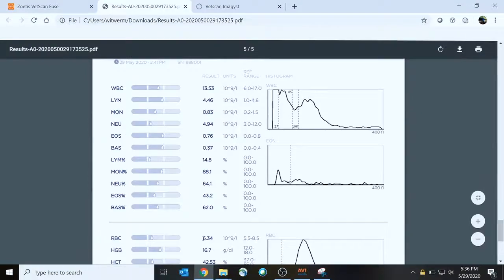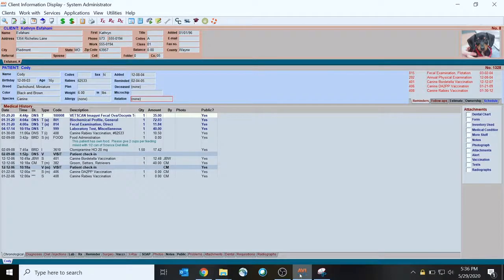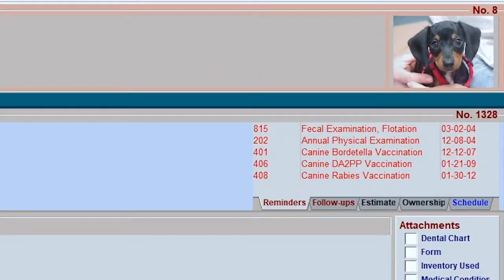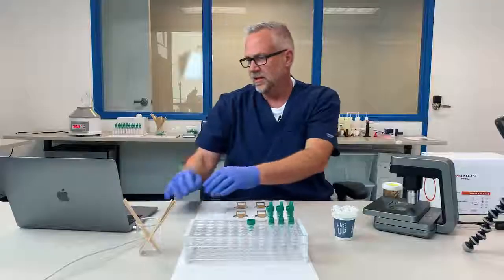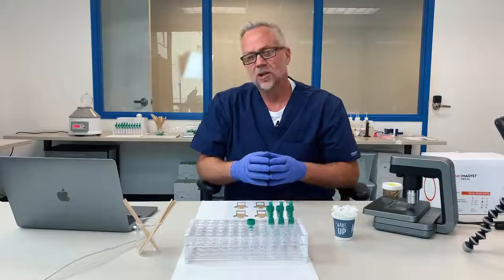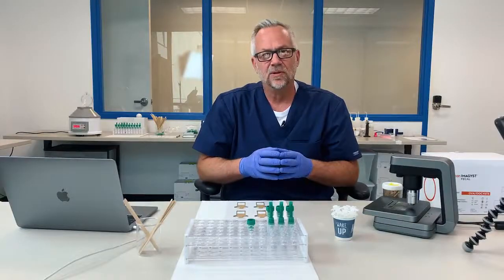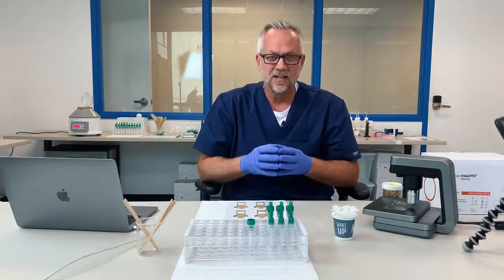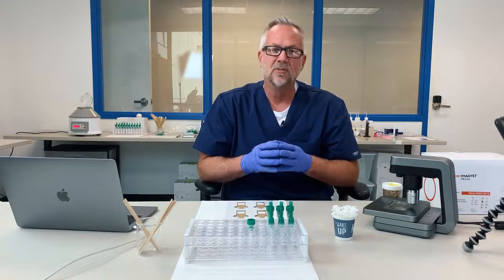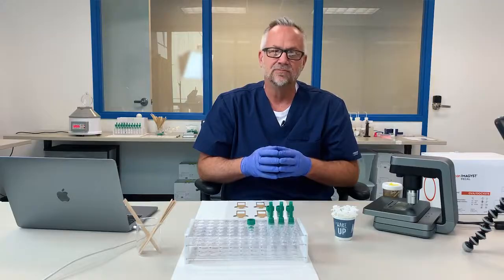Or back in their PIM system under the correct medical record for Cody, patient 1328. And that's it — quick and simple. That is the end of the demonstration, and we thank you for your time.